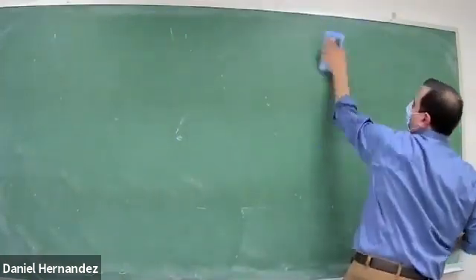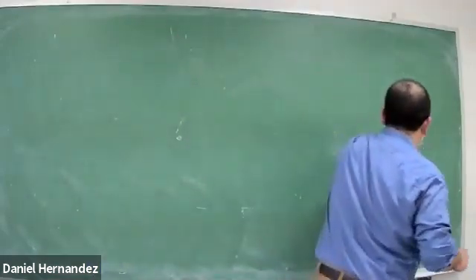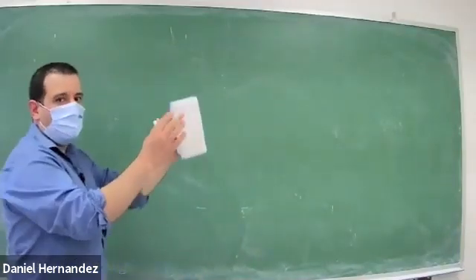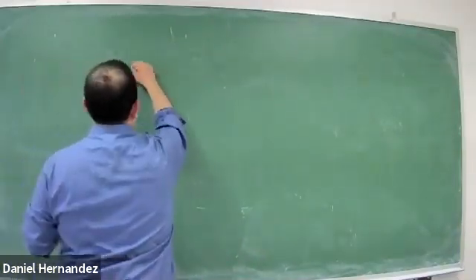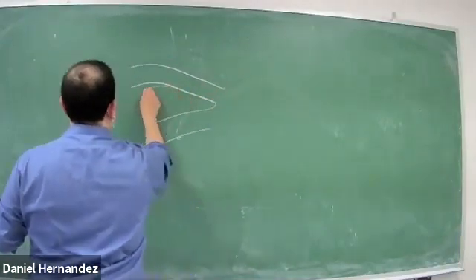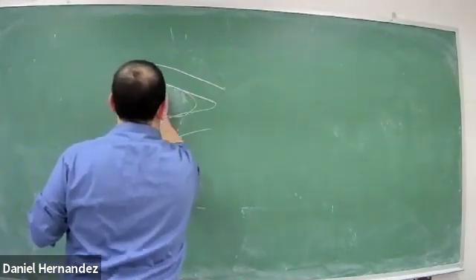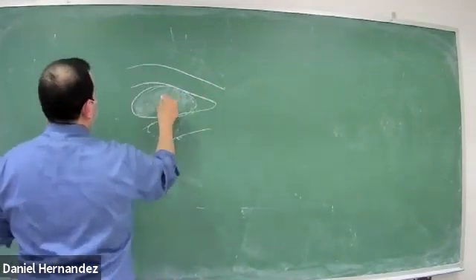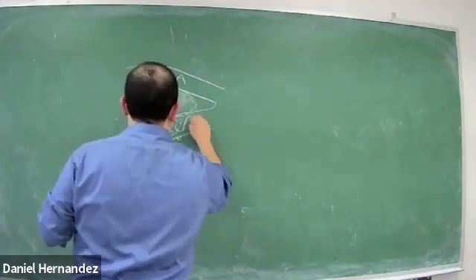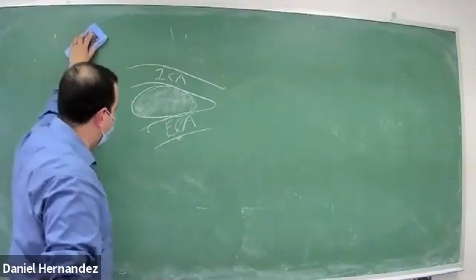It's going to be this heterogeneous mass that has some vascularity that sits between the external and internal carotid arteries. So it's going to be right in that fork. You'll typically get a picture of a bifurcation. You're going to have a heterogeneous looking mass sitting right in between your ICA and your ECA. That's going to be your carotid body tumor.